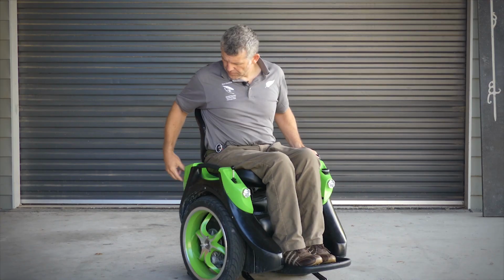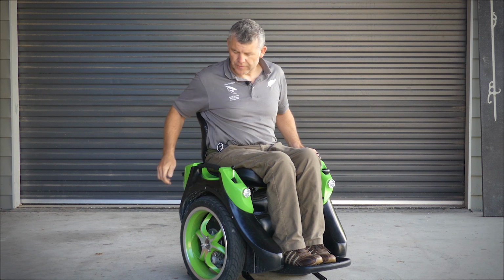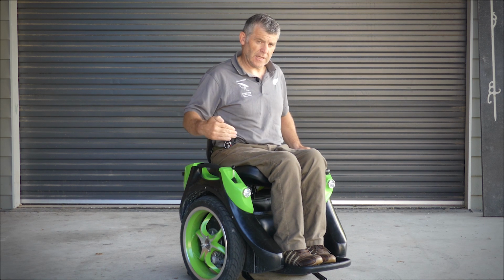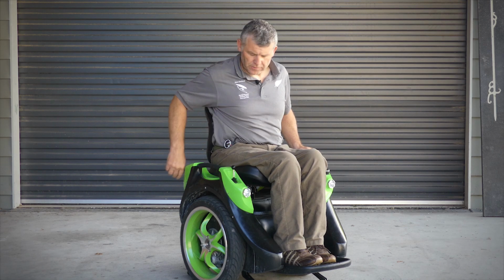So the method, if you end up having gone into a spin and ended up with the legs down, you must always, before you turn the power on, re-level the seat. And we do this by power off, legs down, flick over to active seat control, swing the seat to level on our crossways axis, rock back and forward, make sure you're comfortable, back onto joystick.